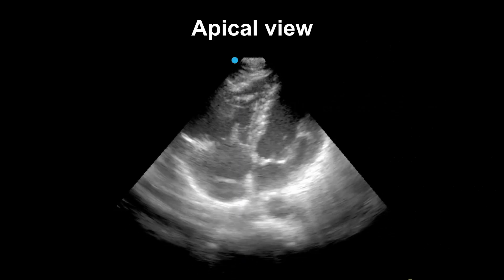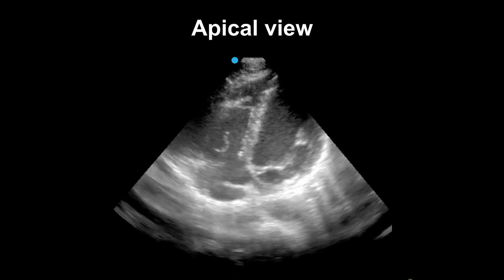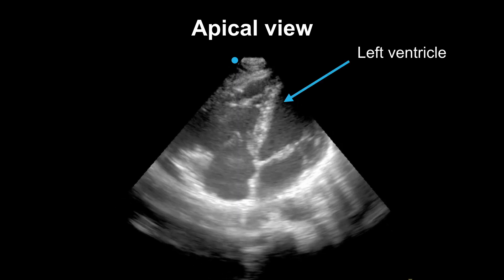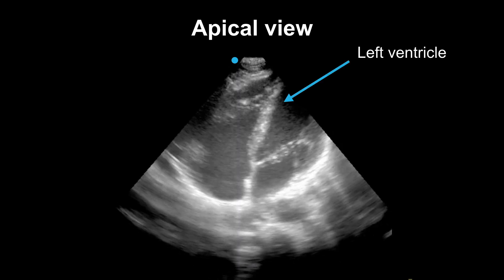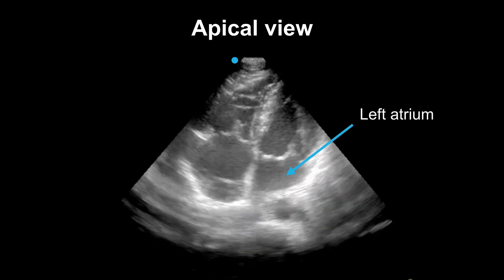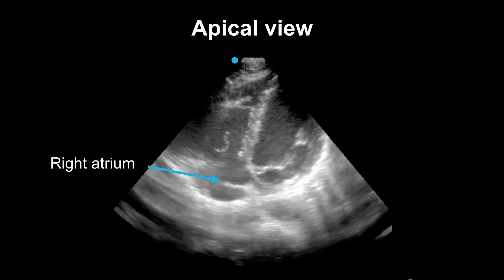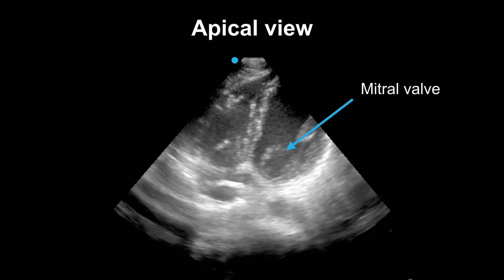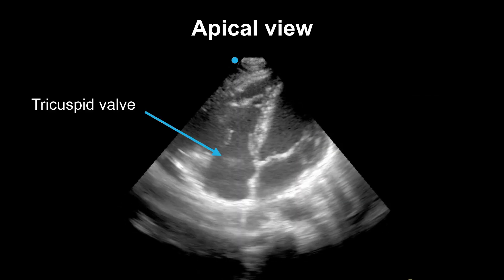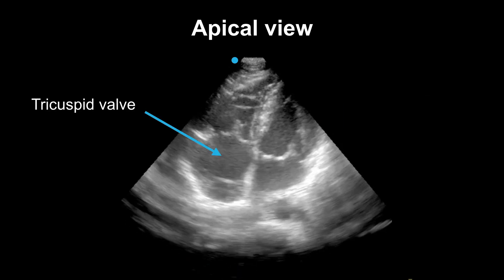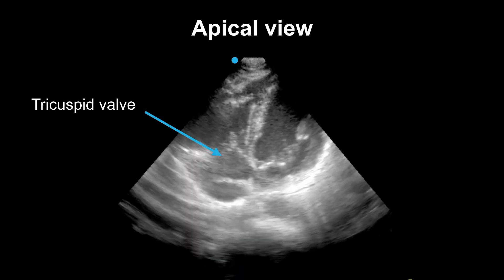Here's a video. Again to orient: you have your right and left ventricles on the top, your left atrium and your right atrium, and your mitral and tricuspid valves in between your chambers.